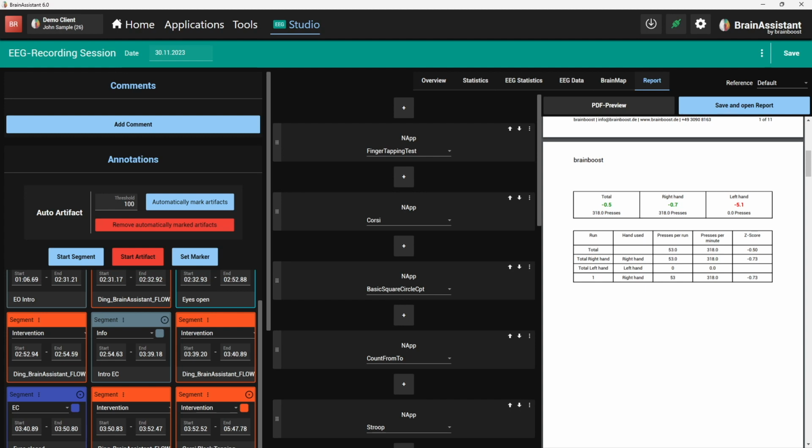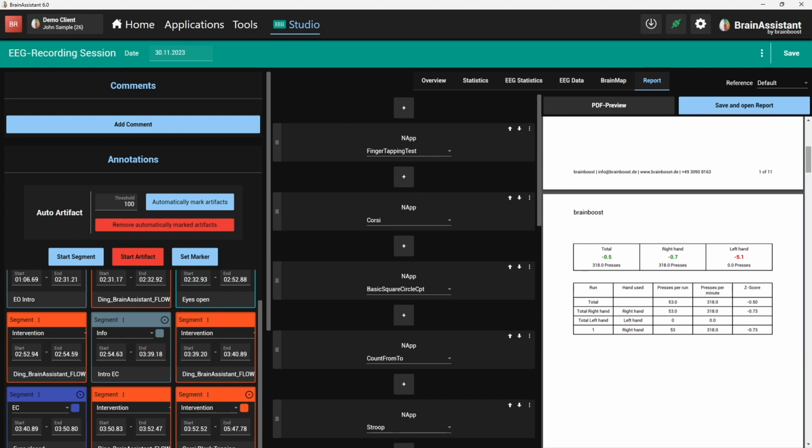Very important at this point, whenever you watch the recorded webinar, this might have changed, but all Z-scores are about grown-ups, okay? So when you do reaction tests with kids, of course, there are going to be different values. So we took a look at a lot of papers, and we took values about grown-ups. So these Z-scores are for grown-ups only, okay? We will add kids. If you have nice research on one of those 5 tests, and you say, hey, this is a nice research paper or meta-analysis, please give it to us, and we can implement it.